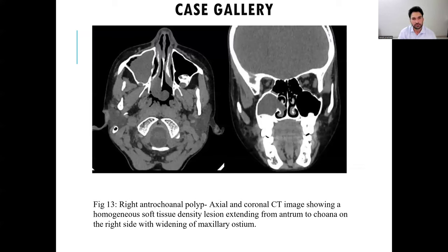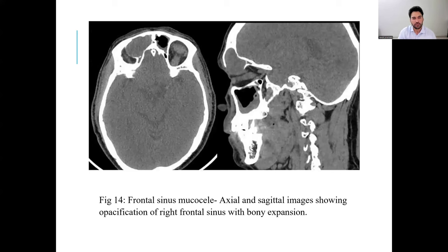In the axial and coronal planes, we can see a homogeneous soft tissue density lesion expanding from antrum to choana on the right side with widening of the maxillary ostium. In another image, axial and sagittal views show opacification of the right frontal sinus with bony expansion.